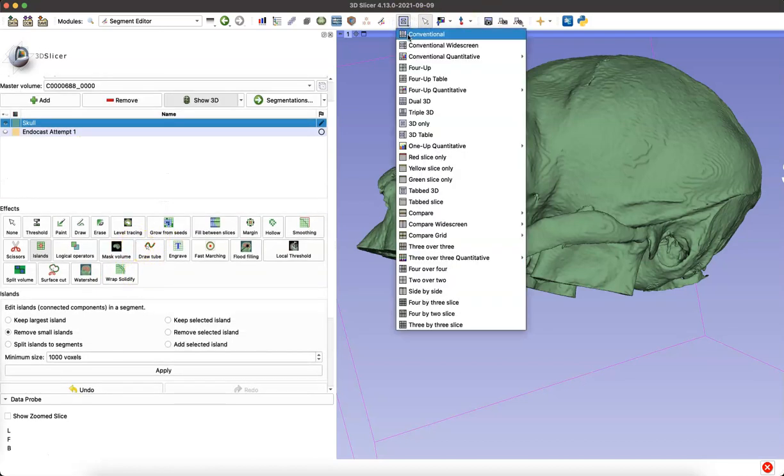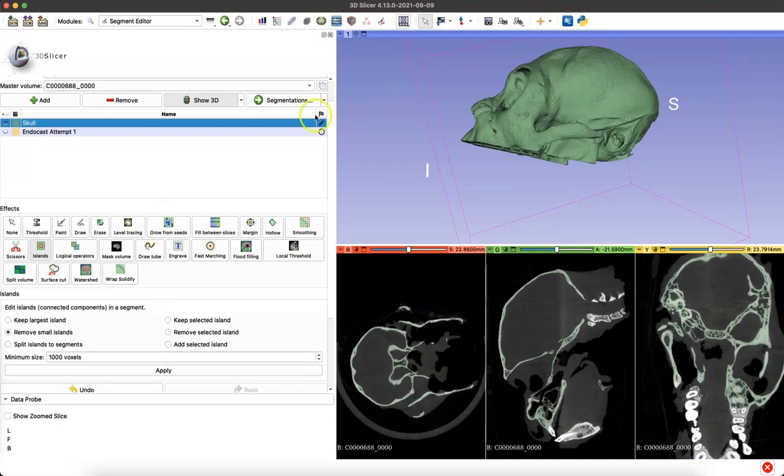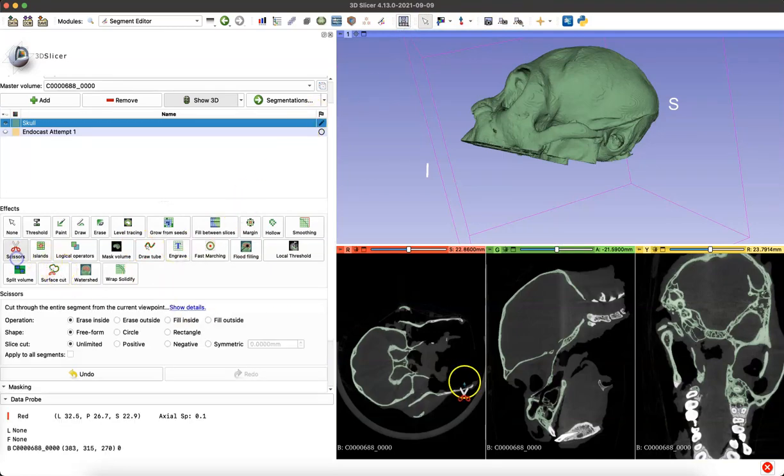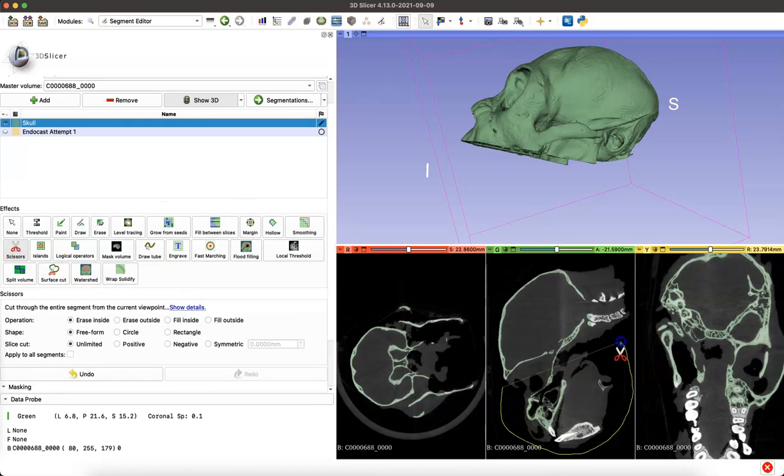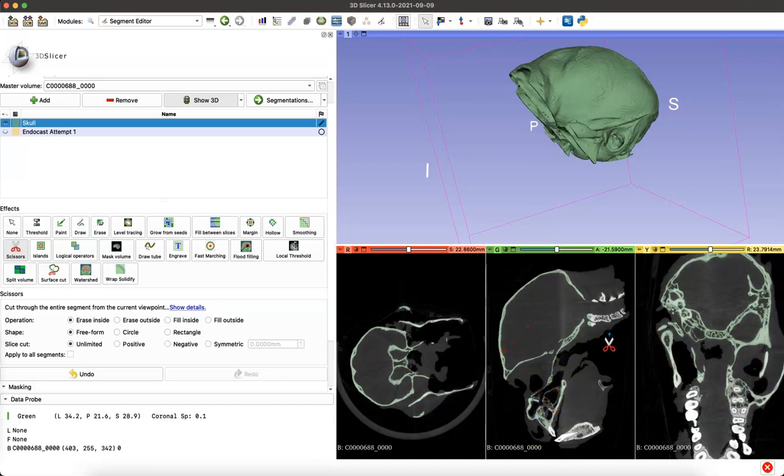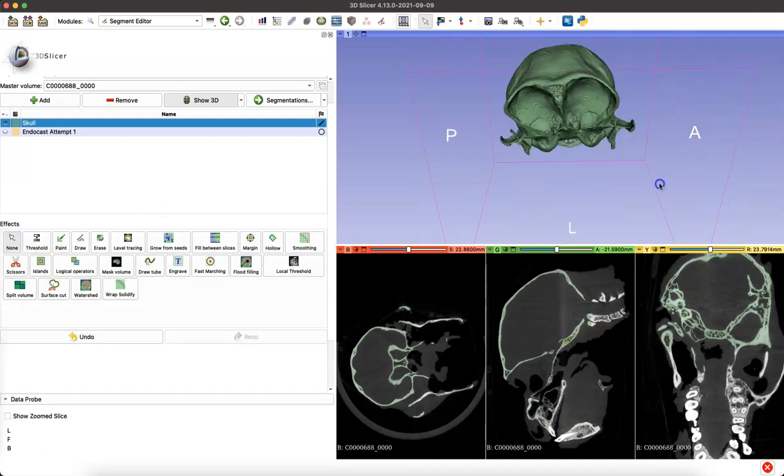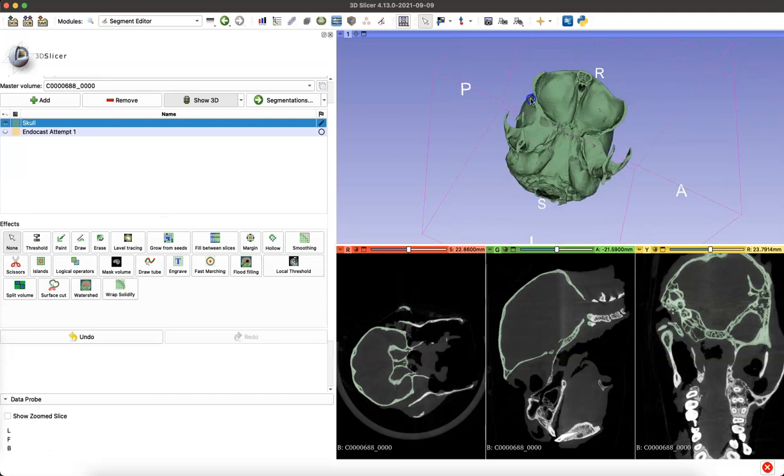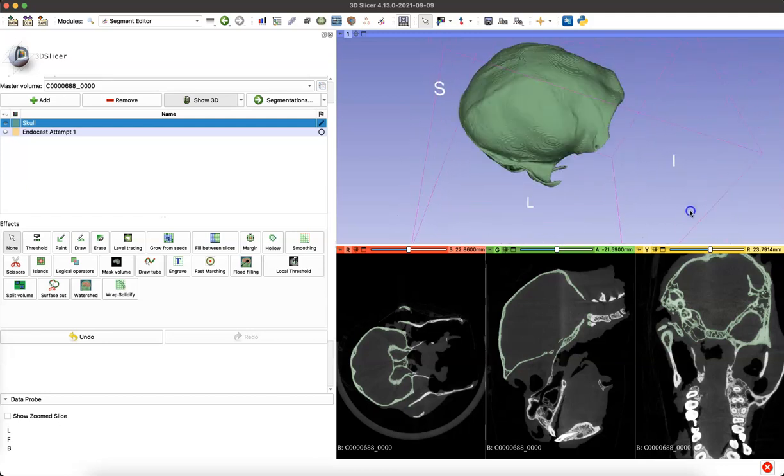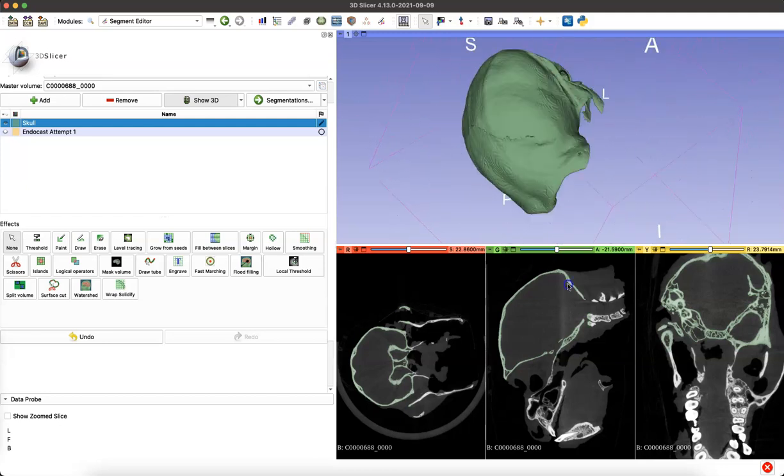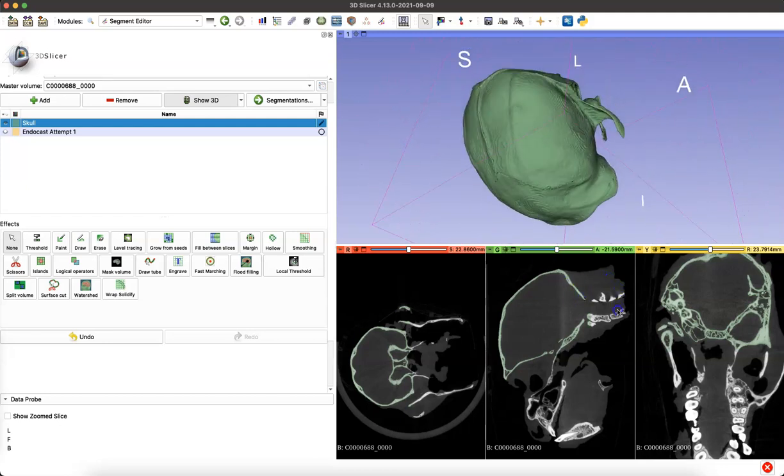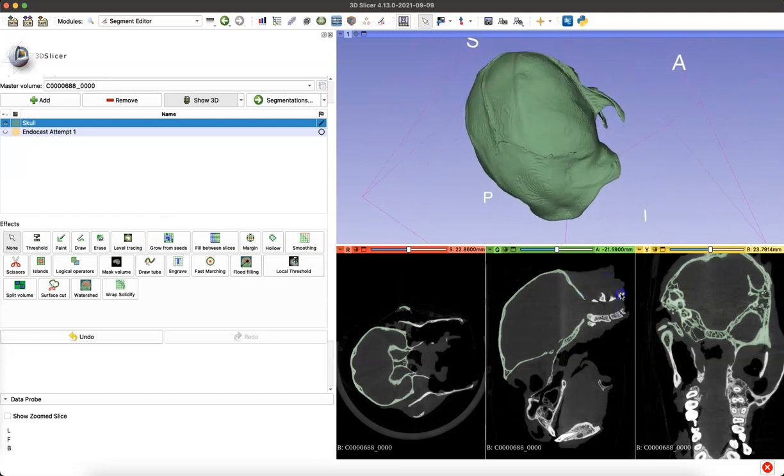I'm going to switch back to the conventional mode and again use the scissor tool to just cut out everything below the neurocranium. The information we want is in the endocast, in the neurocranium, and everything else is unnecessary to make the endocast. So I get rid of that, and I can move the skull that we've now created in 3D space and see I haven't accidentally cropped out too much.